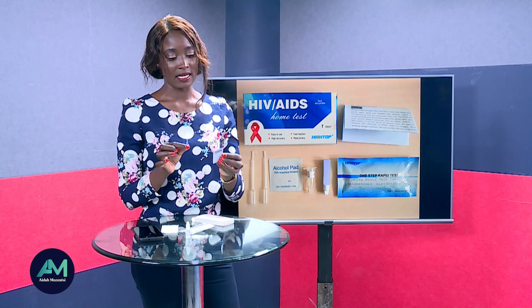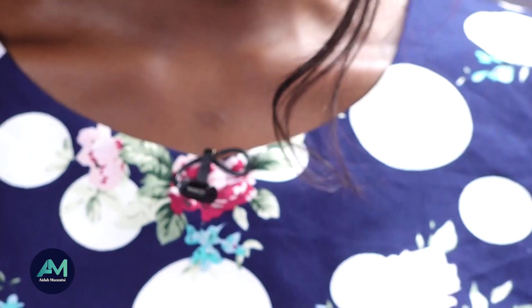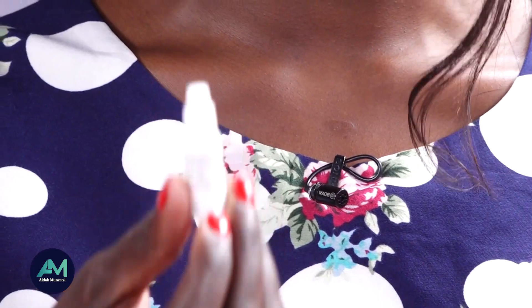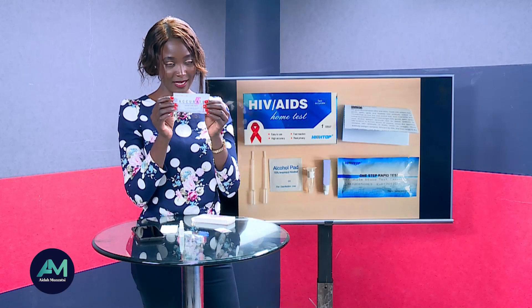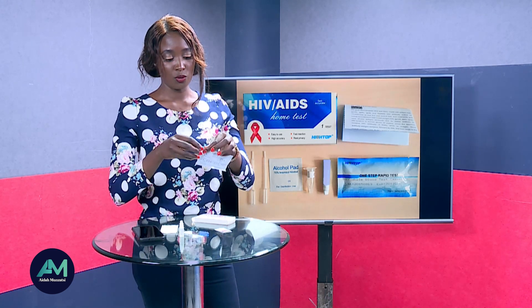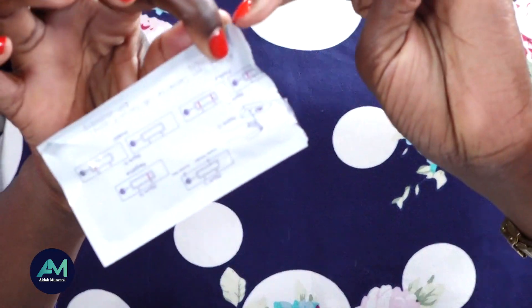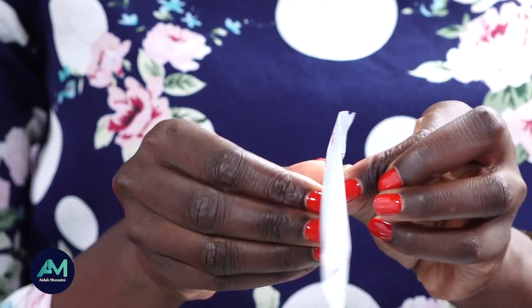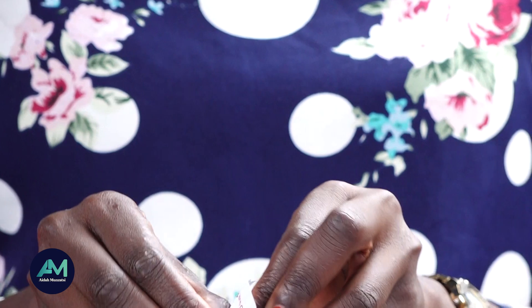This one is an alcohol swab that you'll use to wipe your finger before getting the blood. This one here is a liquid to help in diluting the blood. And this is the main test — you cut it open using your hands; you'll see spaces in the corners to help you cut.